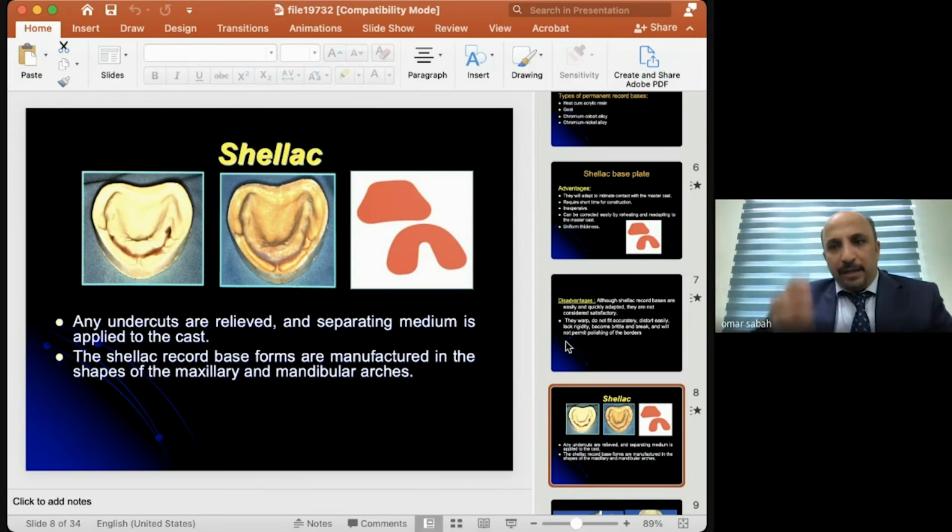And this line indicates the midline of the cast. Also the lower and the upper trimming have different procedures. The lower is rounded, just the canine borders and the retromolar area borders, and the upper has canines and midlines to show you if the patient has a shifted mandible or maxilla.